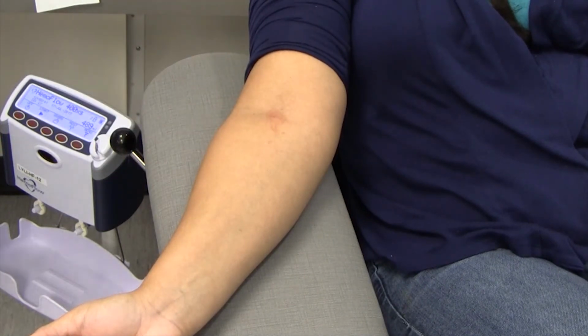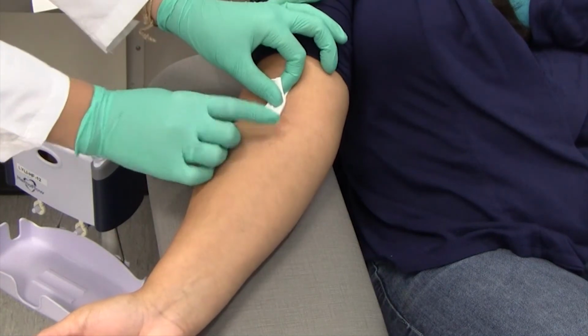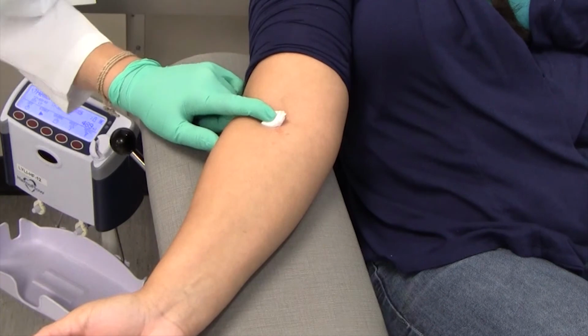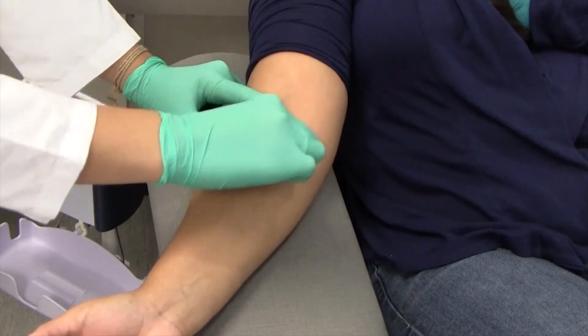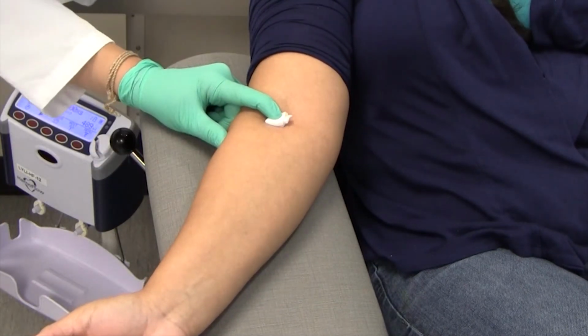Ensure bleeding has stopped. Place an untouched corner of the sterile gauze on the entry site. Fold gauze to make a pressure pad. While holding the pressure pad in place, clean the prepped area with alcohol. Place a bandage over the gauze.